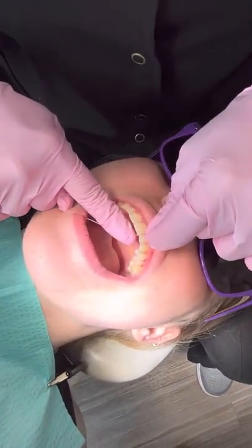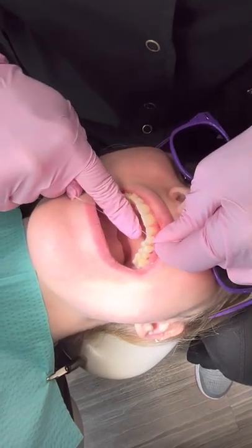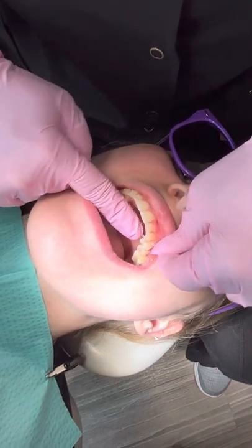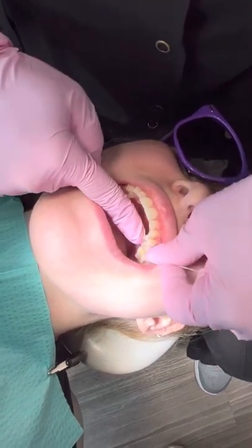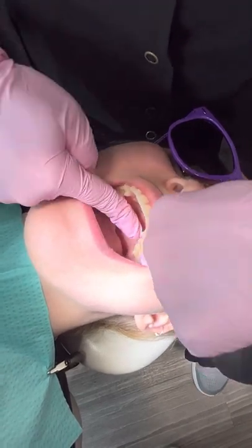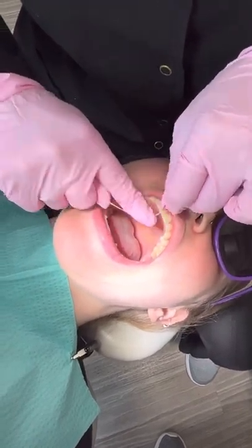Each time you floss, you want to make sure that you run your finger over the floss. That will ensure that you're removing any plaque the floss might have on it and not just pushing it into another contact. As you go further back, you can unwind to get further back. And if you come more forward, you can rewind your finger to make it smaller.